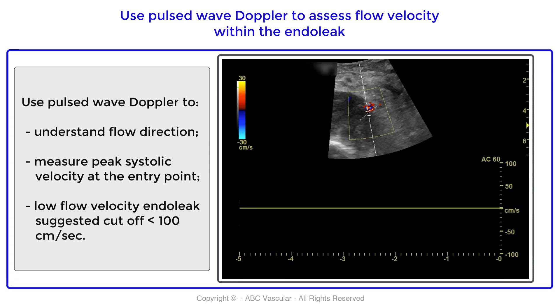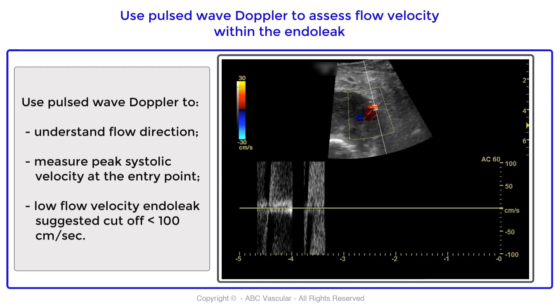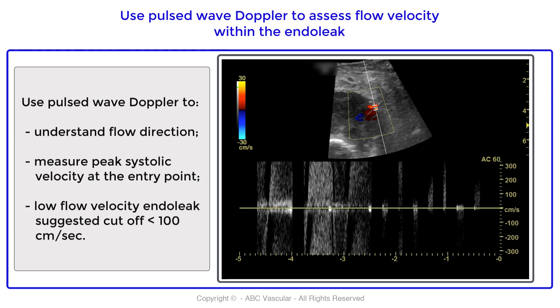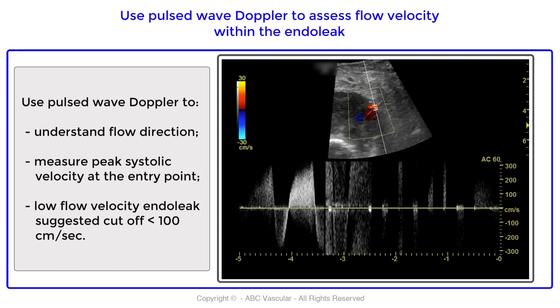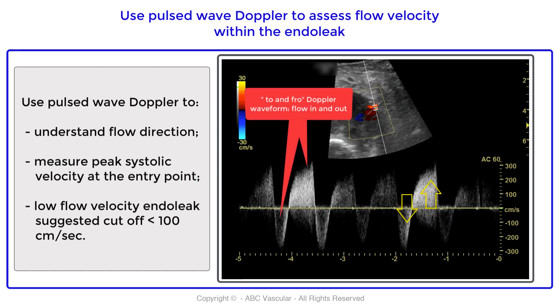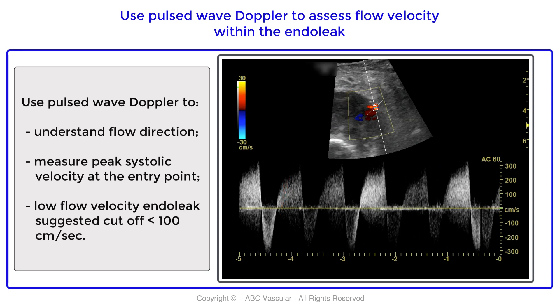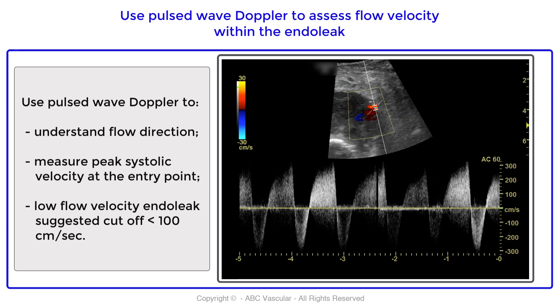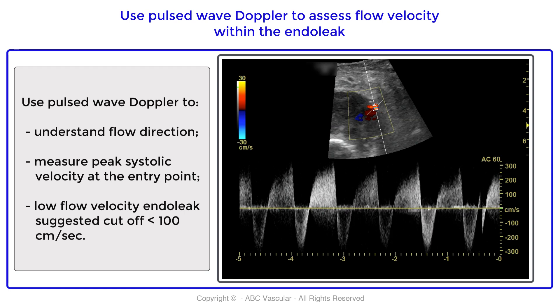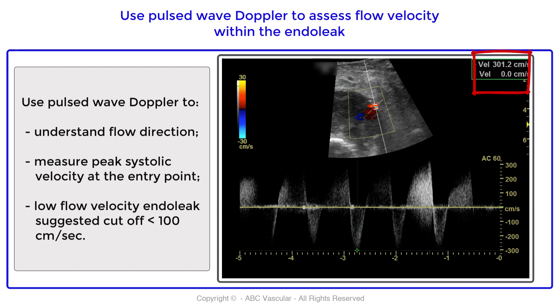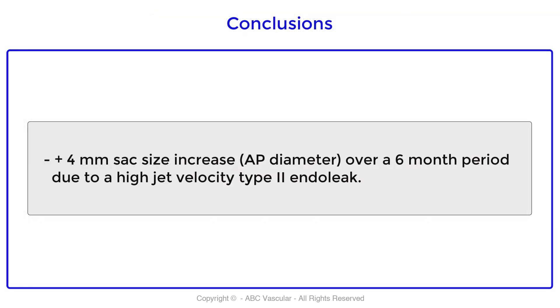There is turbulence visible, indicative of high jet flow. Applying pulse wave Doppler at the entry point gives the typical to-and-fro flow pattern characteristic of a type 2 endoleak. The measured peak systolic velocity is 300 cm/s. The cutoff value to define a high-velocity endoleak is 100 cm/s. In conclusion, we have identified a type 2 endoleak with high jet velocity.